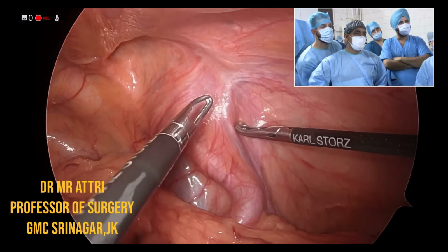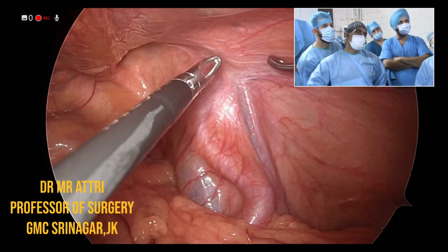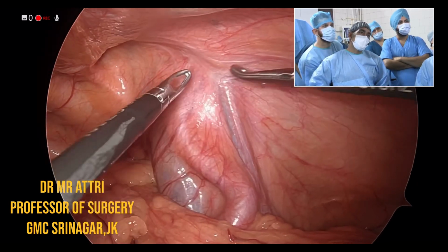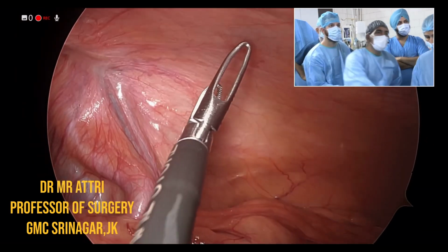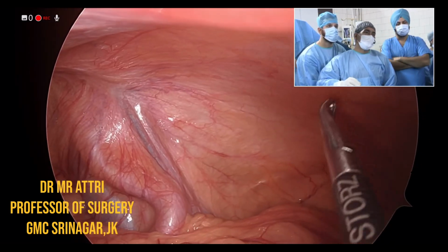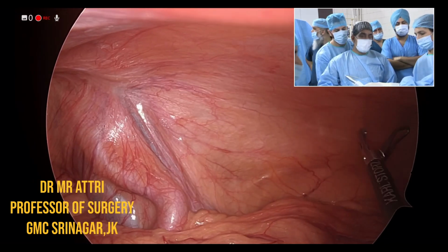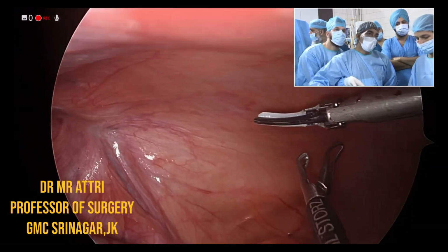So these are the testicular vessels here, and this is the vas going. Maybe possibly because of previous surgery, there is some sort of distortion here in the internal ring, but it's okay. And we will be starting our peritoneal incision almost 2 centimeters anterior superior to the anterior superior iliac spine, and then we will proceed.